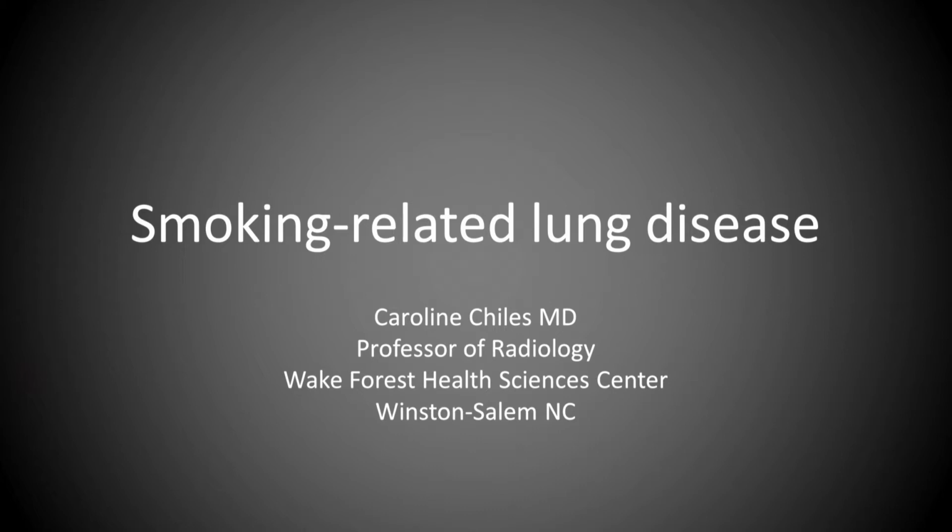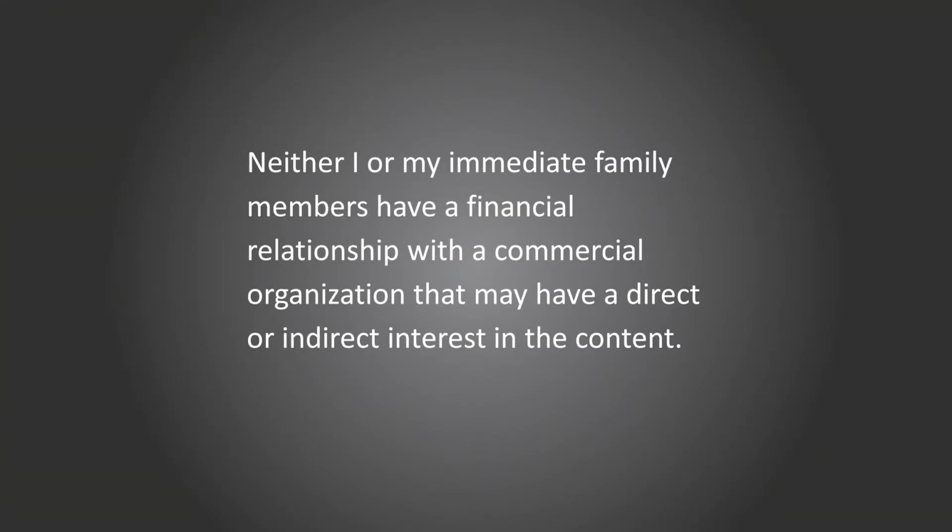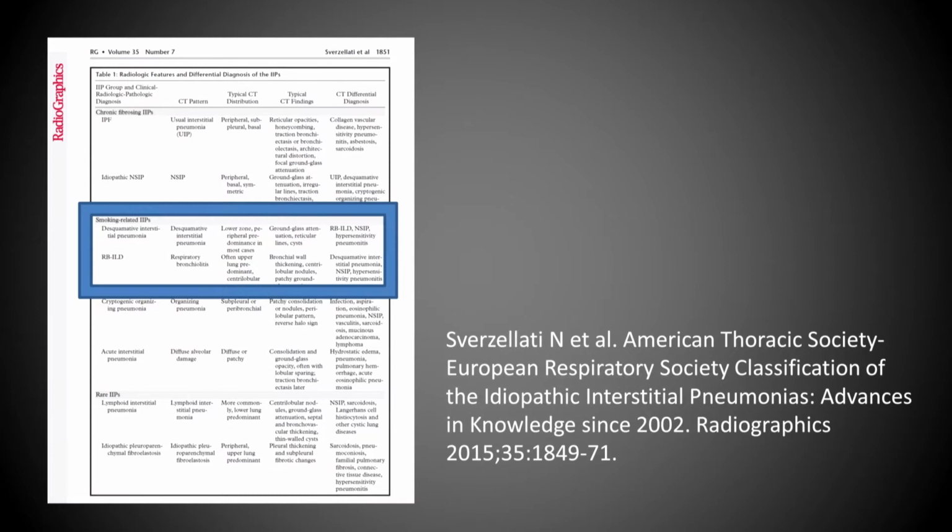We're going to move on to smoking-related lung disease. I live in a tobacco state, North Carolina, so I see a lot of smoking-related lung disease, as probably you do as well. So, not to overwhelm you with guidelines, this was the 2015 classification from the American Thoracic Society and the European Respiratory Society, classifying the idiopathic interstitial pneumonias.